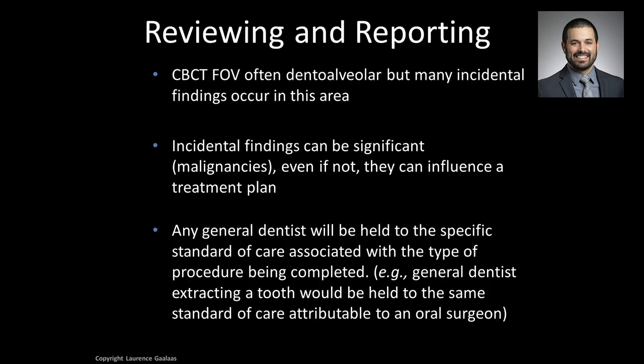Building on this, many offices will elect to take a dental alveolar, so jaw scan only, to avoid incidental findings. They can avoid the skull base and spine, that's great, but there are many incidental findings that can show up in the jaws as well, so you're not fully safe. The incidental findings can be significant, like the rare malignancy, but even if it's something small and ignorable, a note-and-move-on finding like a dense bone island, it might actually influence a treatment plan. So you do need to pay attention.